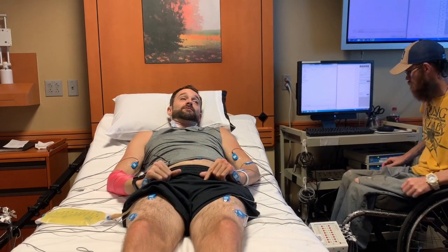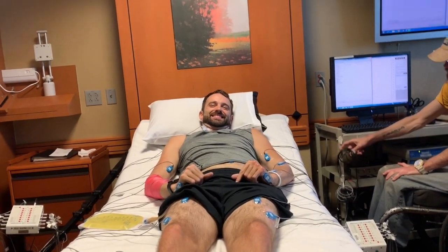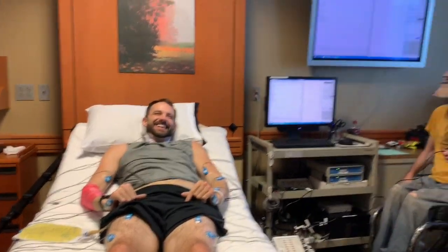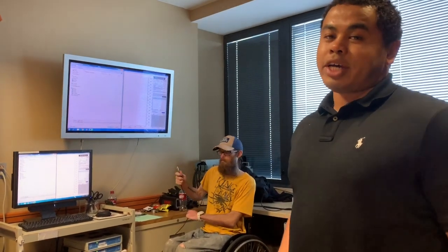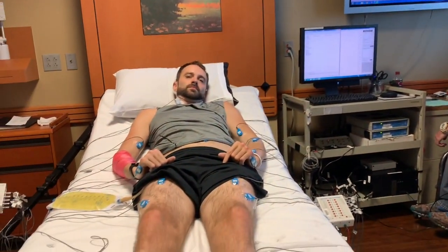It's a functional neurophysiological assessment. Jared's mouthing along — he knows better than I do at this point. For this one we'll just be testing Jared's muscle activity — what type he's able to elicit through voluntary movement. I'm going to have him run through a variety of different tasks.